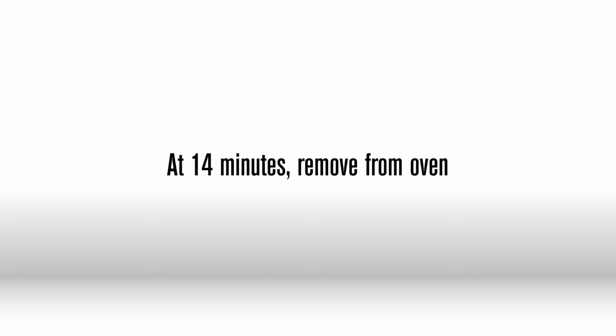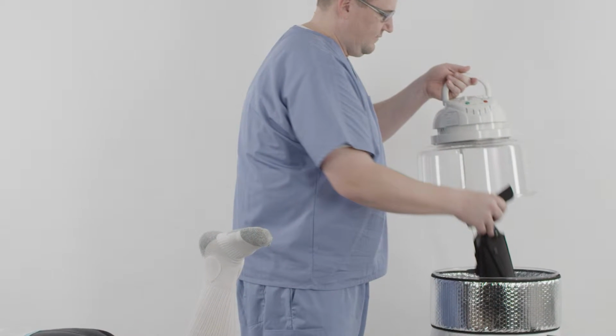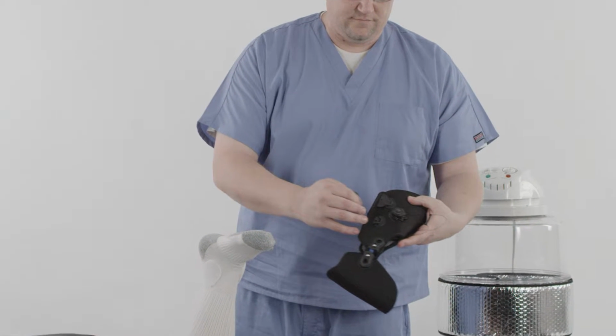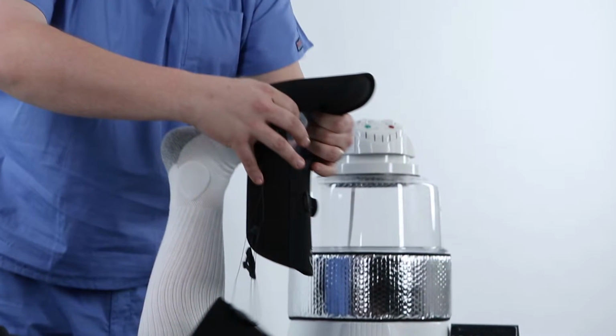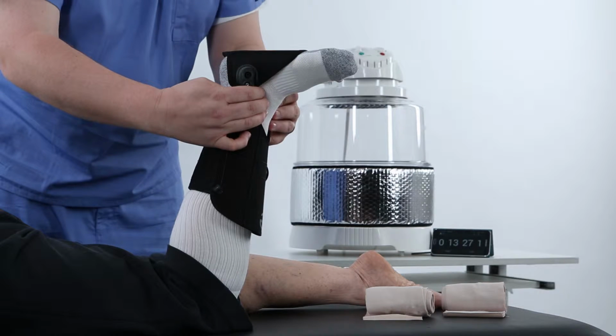With 14 minutes remaining on your timer, remove the brace from the oven. Pull up on the boa reel, loosen the lace, and release the boa clips. Remove the tongue from the brace. Slide the brace onto the patient. Align the ankle joints with the malleoli apexes.